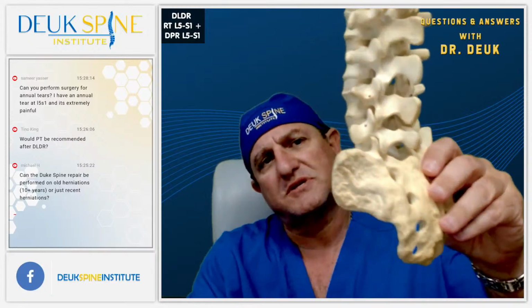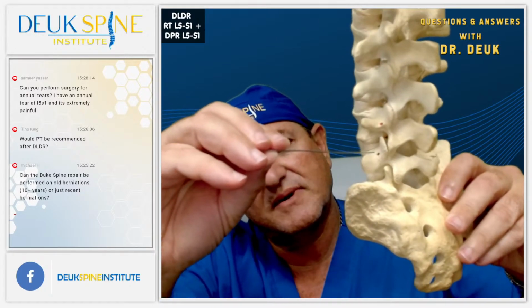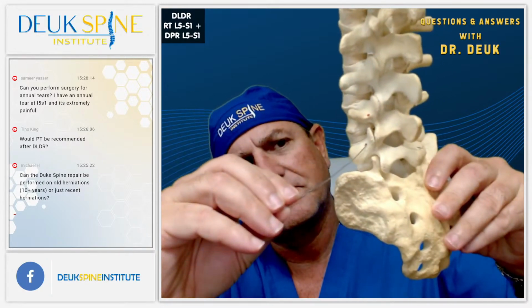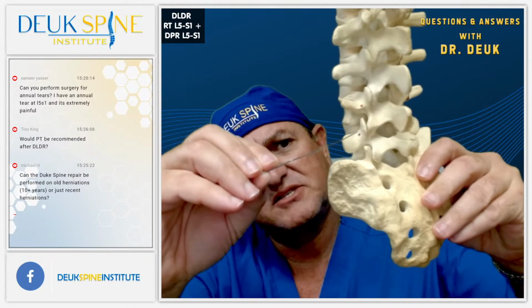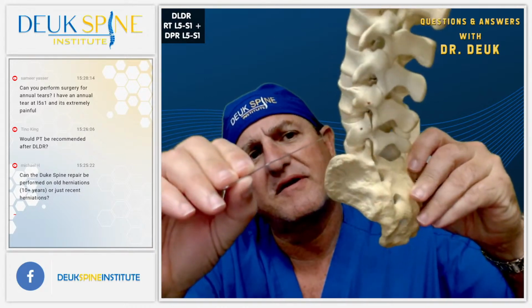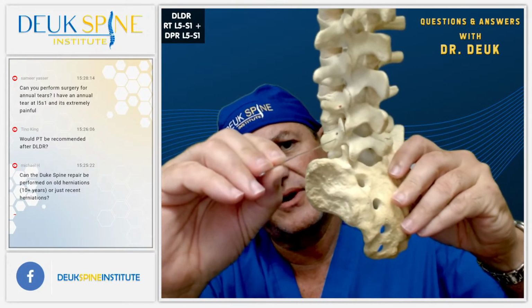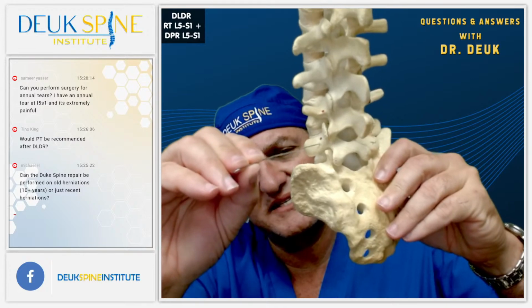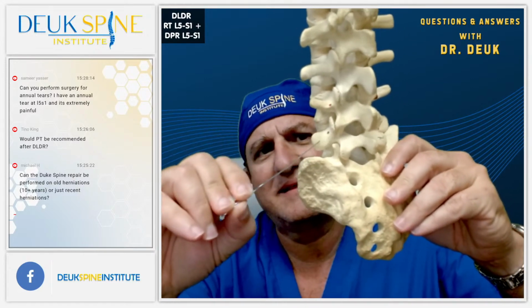A radiofrequency ablation, the target for the pain nerve is right here. You guys see this right there? Right where the transverse process, this little thing, meets the facet, right in that valley is our target. The problem with RFA, you can see the little red dot, is the doctor will stick a needle there, heat it up to 80 degrees Celsius for 60 seconds or 90 seconds, burning. But that's all you get. They get that little spot right there.